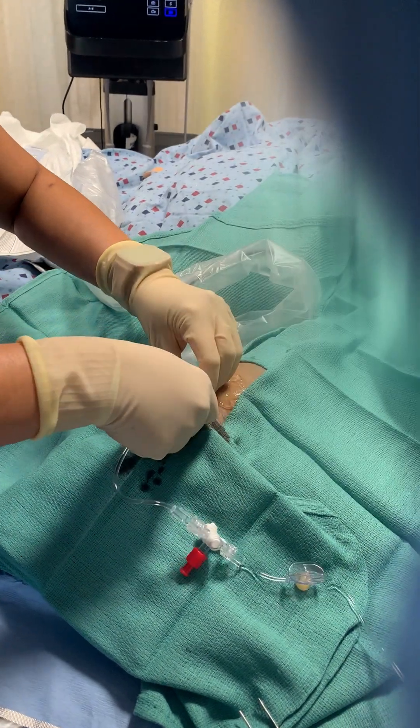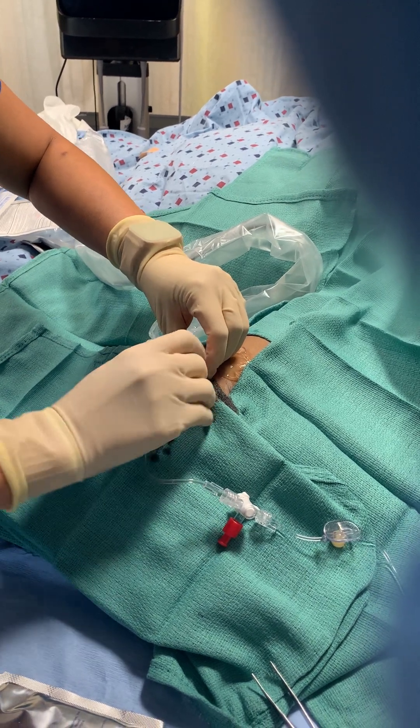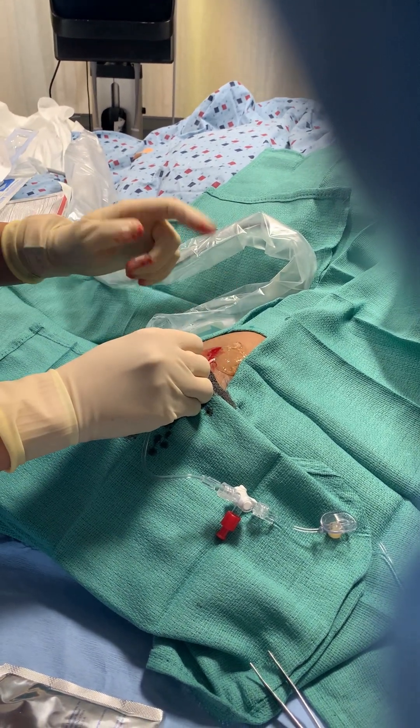That's how you do it. It's now connected and we're just going to stitch it up.